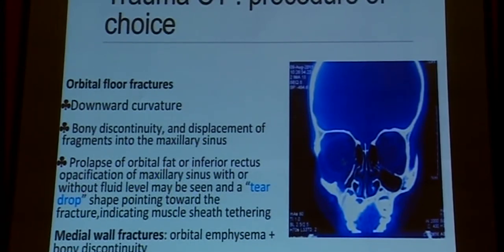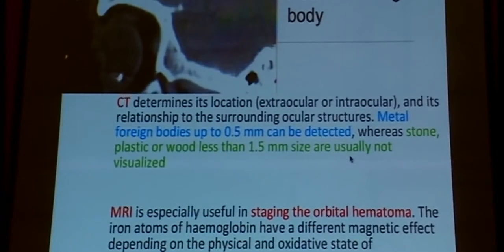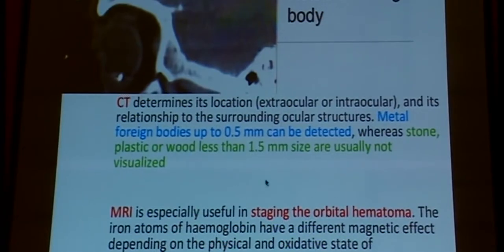You can very clearly see - it's so easy to identify an orbital floor fracture. You can see the teardrop sign. You can pick up a medial wall fracture as well. Also, if there is a foreign body, 0.5 mm of a metallic foreign body can be picked up by a CT scan. Whereas if it's a plastic or wood foreign body, maybe a larger size would be picked up.